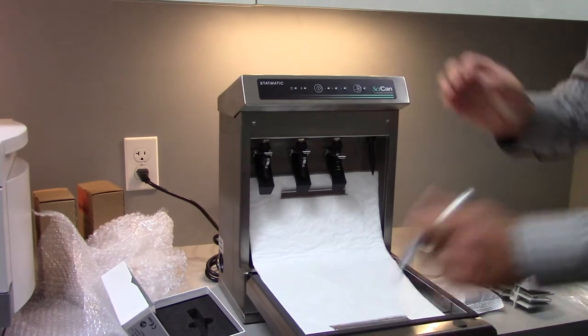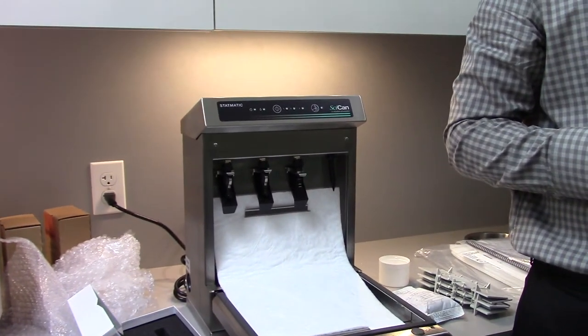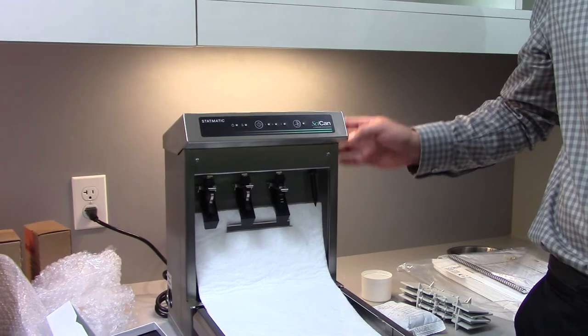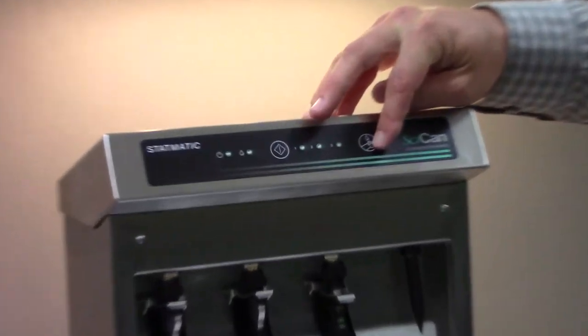Is there any knobs? Because with some oilers, like the one I use, we have to turn a knob for the oil or the air. This one has the cleaner and the lubricant in one. We'll really only have to hit two buttons for this, the start button and then the chuck cleaner. So it's super easy to use.